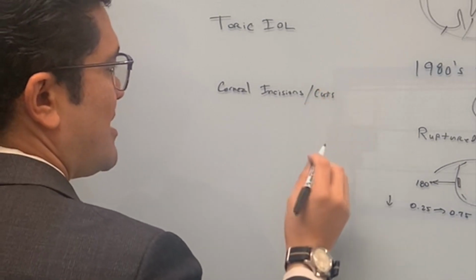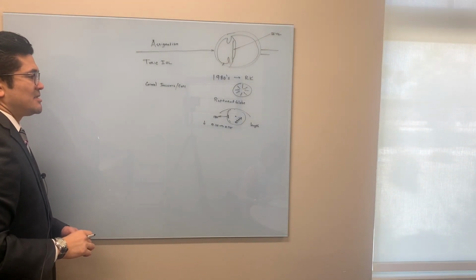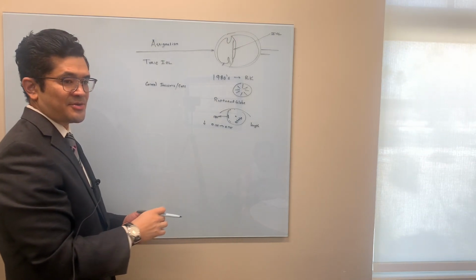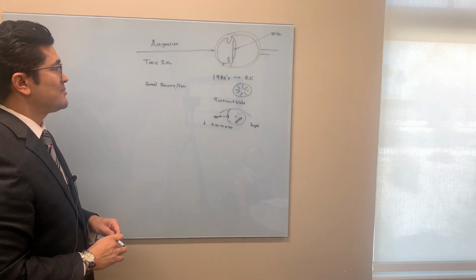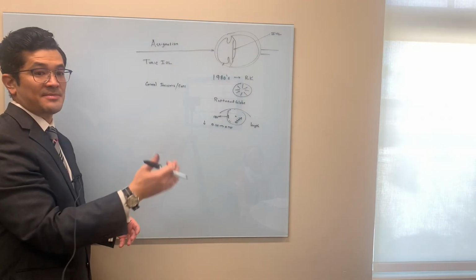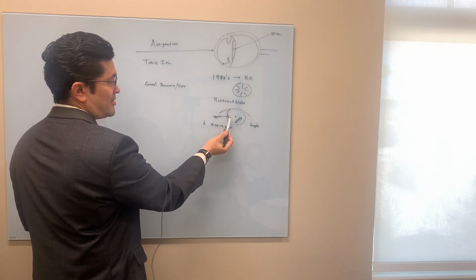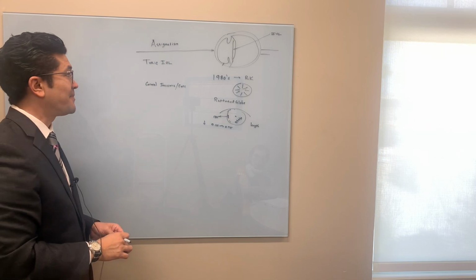Or cuts. That's going to alter astigmatism. So we really like to look at where our cornea steep angles are. On our cataract patients, if we're looking to manage astigmatism, we're looking at topography, we're looking at the shape and the parts of the cornea that are steepest. Because now I can just, without doing anything extra, change the angle where I enter the cornea, and that will help reduce astigmatism.